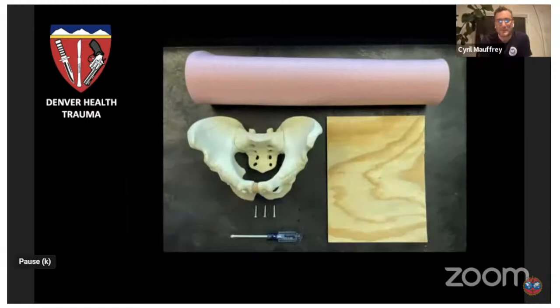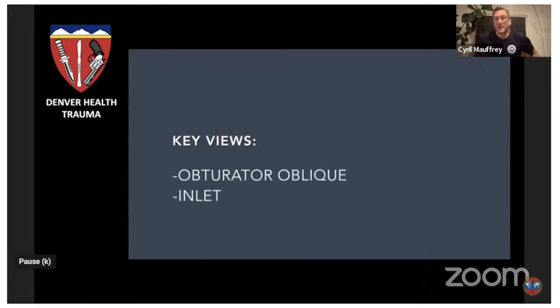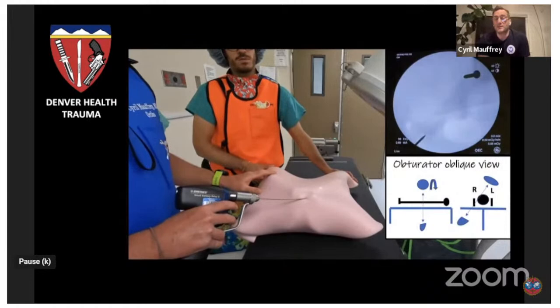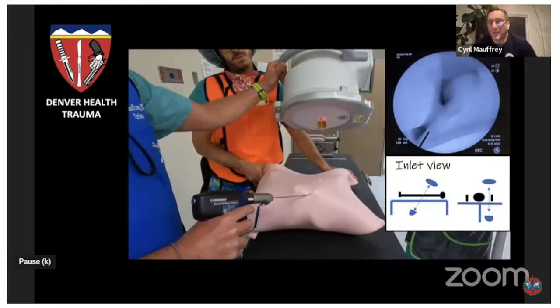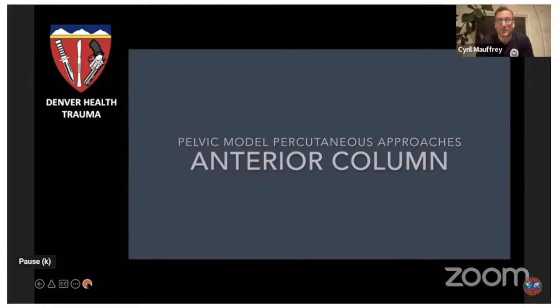Through this website, I've done a lot of videos there, and I'm not going to show them all because they're all accessible for free. But I'm showing you the technique to put an antegrade or retrograde column screw. So this is the technique for a retrograde anterior column screw, the views that you need, how to position and what you are looking for in each of those views. The beauty is that this takes into account the very short attention span of orthopedic trauma surgeons. My personal attention span is about 2.5 minutes. So I've limited those videos to about 2.5 minutes so that people who want to learn how to do that can learn. And so this was the anterior column.